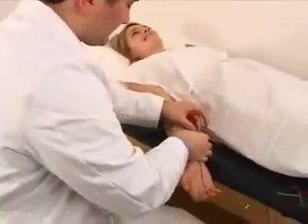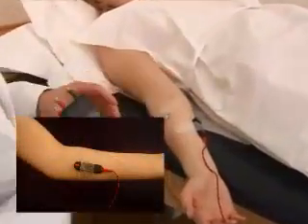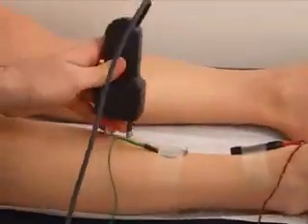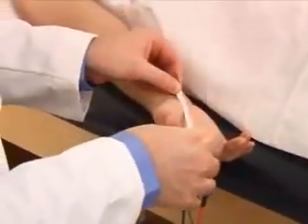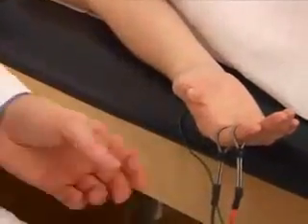In the assessment of more complex disorders, such as brachial plexopathies, testing of the medial and lateral antebrachial cutaneous nerve is required, while testing of the saphenous nerve is necessary in the evaluation of femoral nerve disorders. As the EMG test progresses, the examining physician customizes the test according to the recorded responses. Each and every test is tailored to the patient's needs.